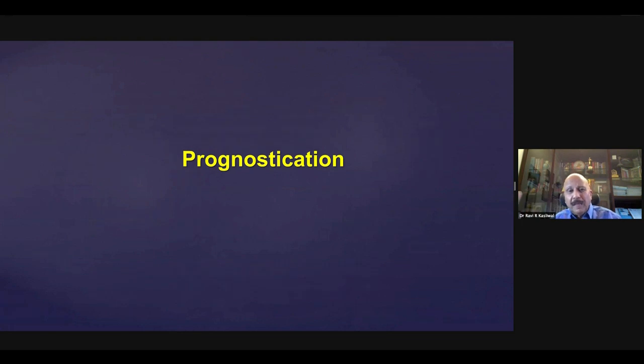So we are good at picking up. We are good at identifying. But are we also good at prognosticating? Yes, stress echocardiography is also good at prognostication, far better than a treadmill testing. Of course, we also employ treadmill testing here, but the prognostication comes because of the use of echocardiography, wall motion abnormality, and all the plethora of information that we can actually get from an echo.